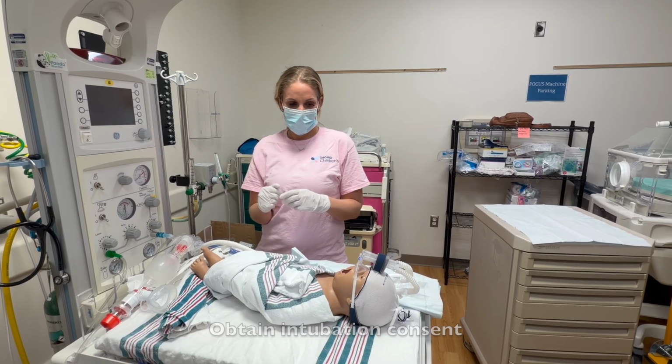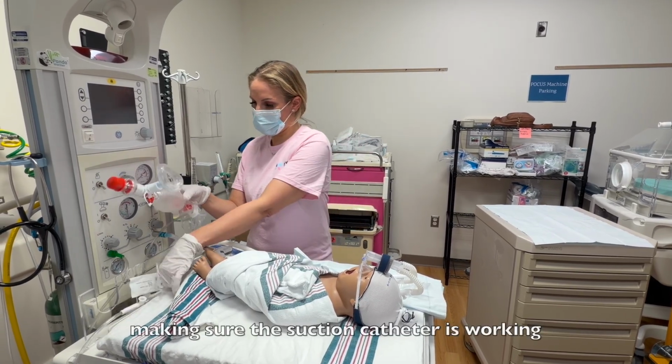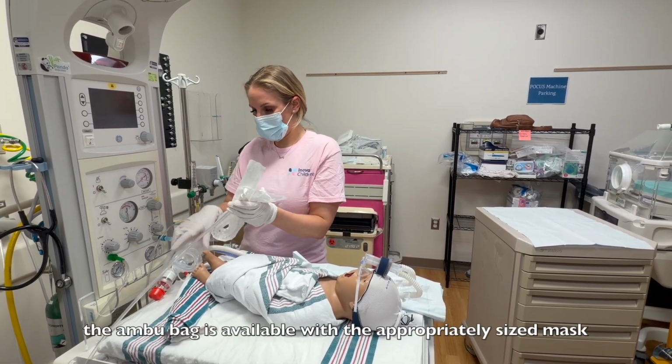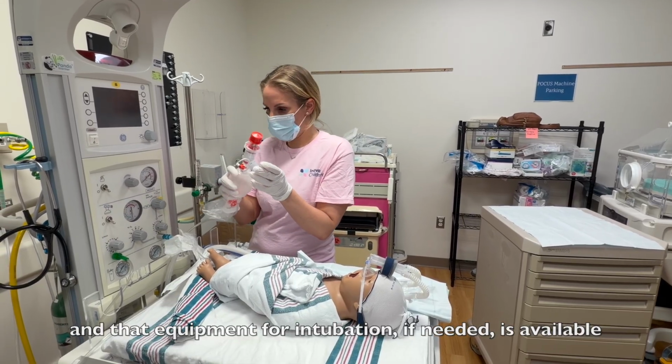Obtain intubation consent. Prepare the baby's bedside as you would for routine intubation, making sure the suction catheter is working, the ambu bag is available with the appropriately sized mask, and that equipment for intubation if needed is available.